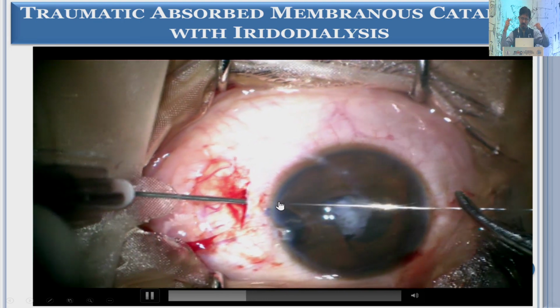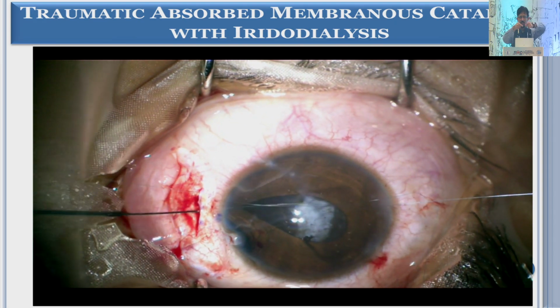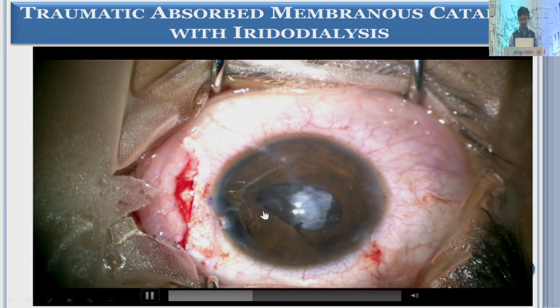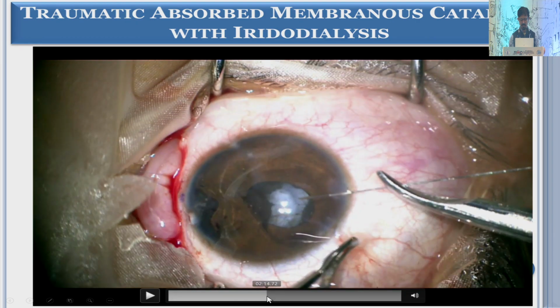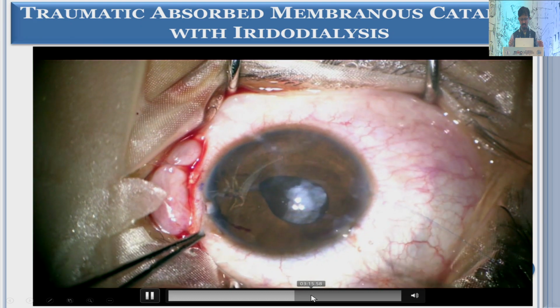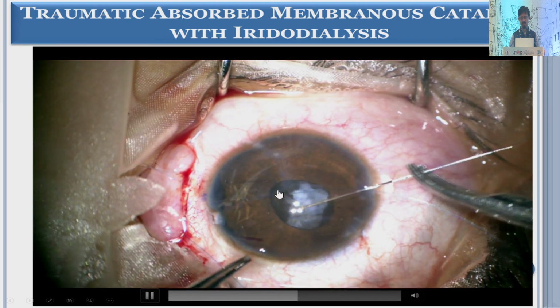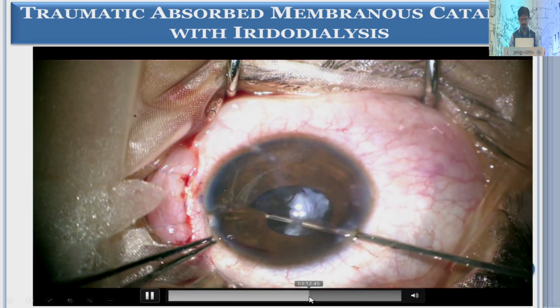And sometimes when you are doing it, what happens is that the iris gets pulled onto one side, so you have to stretch it to bring it towards the center. So as you can see here, it went onto one side, but it started coming again. And then in between, you have to stretch the iris as well. As I stretch it, it comes well in the center. So you just have to titrate the tightness of the suture as well.